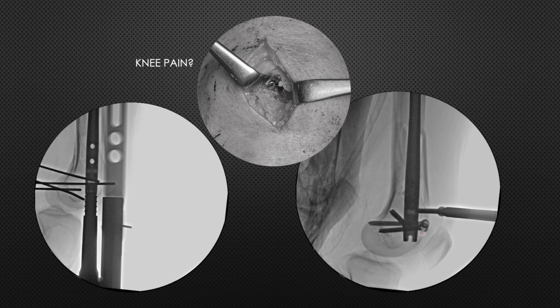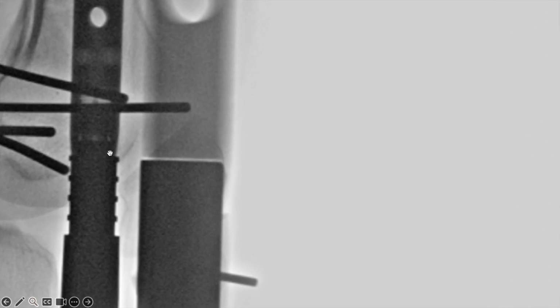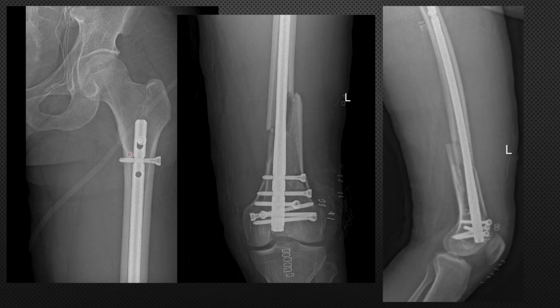So a lateral view is a must whenever you are committing to distal fixation. And also it's better to check in C-arm what is the junction of the jig and the nail. You can go and check the C-arm closely and see what is the junction. So here, you see the junction is quite clearly visible. So that is the ultimate end point of the nail, and it is above the level of trochlea. So you have to ensure that the nail length is correct, it is not proud.